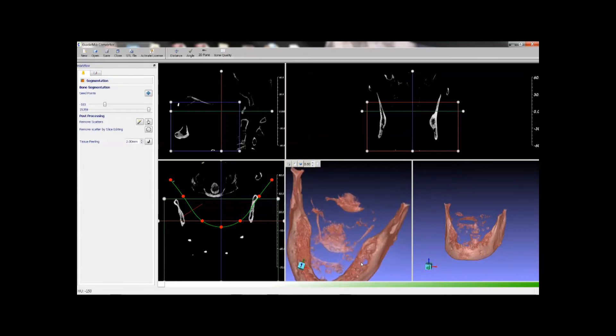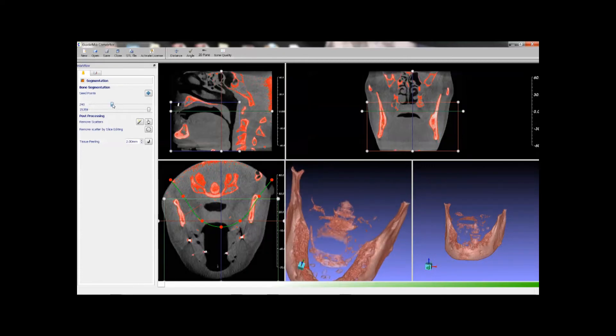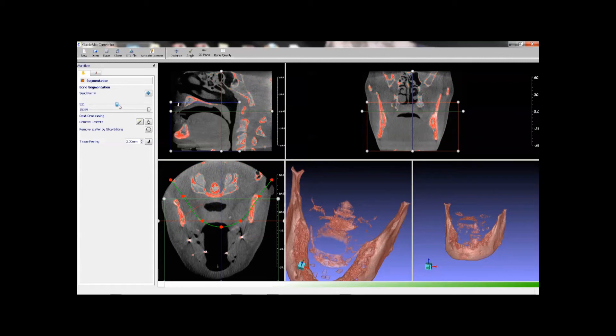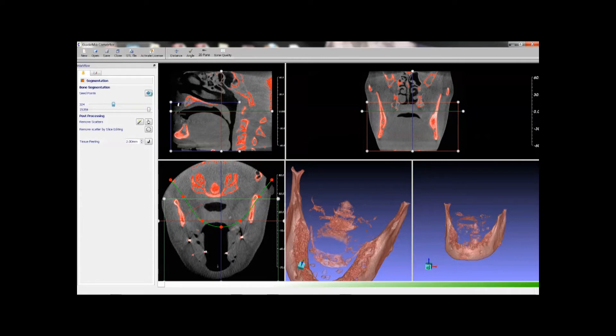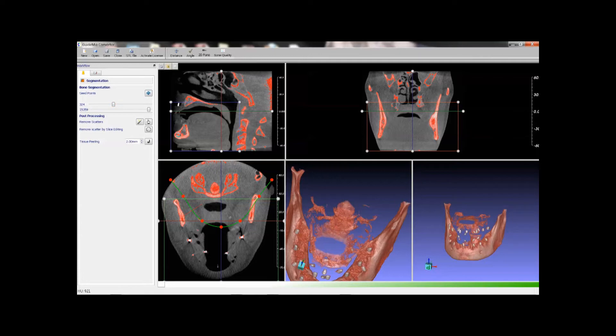Change thresholds. Give a seed point. Then we have a clean model now.